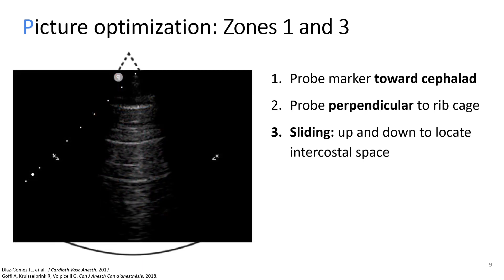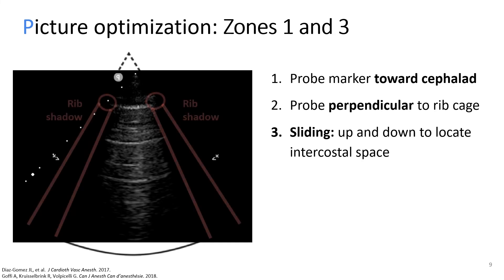Can you tell me where are the rib shadows? There you got them. And the pleural line? Yeah. Cool.